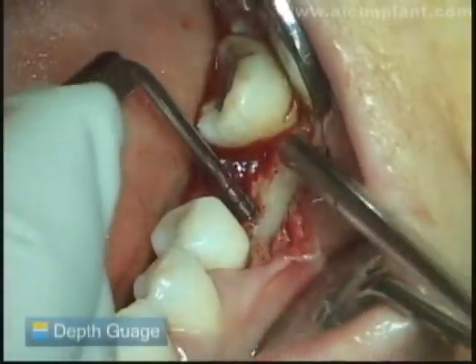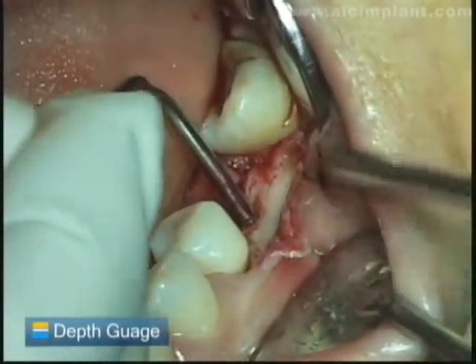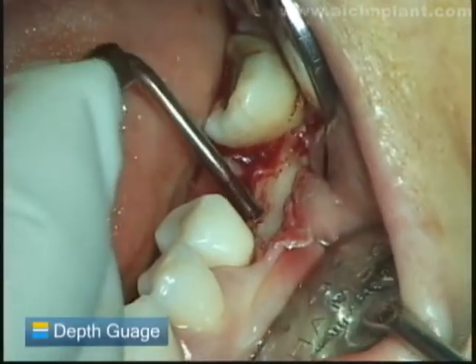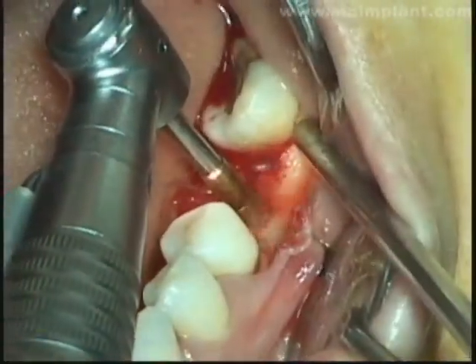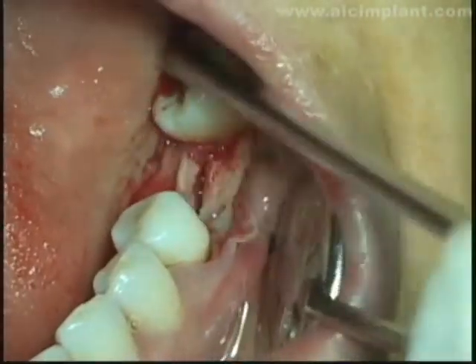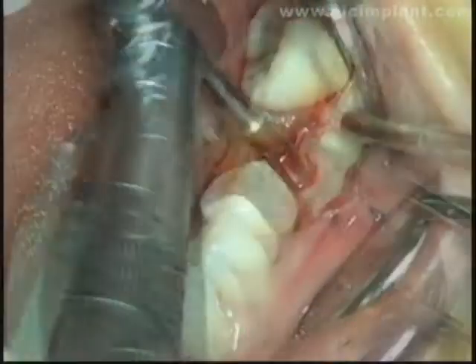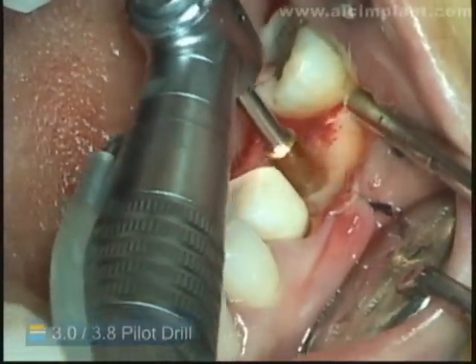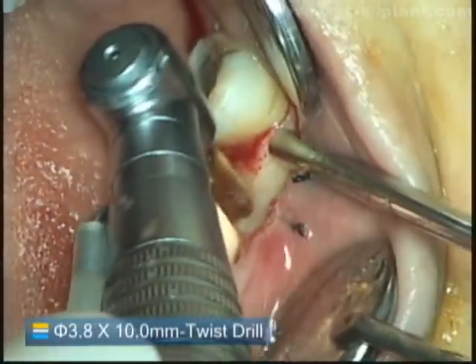Let's see if we have reached 11.5 millimeters. It is better to check, since the depth gauge can go farther than the actual drilling if there is a perforation on the lingual side. Drilling has to be done only on the whole area. A drill with diameter of 4.1 millimeters shall be used as the final drill.